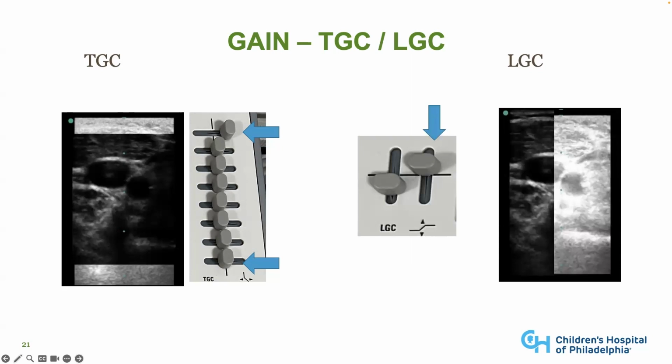One of those things is when we're doing abdominal exams and we are looking at the bladder. The fluid allows waves to transmit very quickly through it, and as it hits the bladder wall surface, it becomes very bright. You have this artifact called posterior acoustic enhancement, where everything below the bladder looks super bright, right? So it's really hard to tell what else is there behind or deep to the bladder. One of the things you could use is this time gain compensation just deep to the bladder to turn that area down so it's not quite as bright.